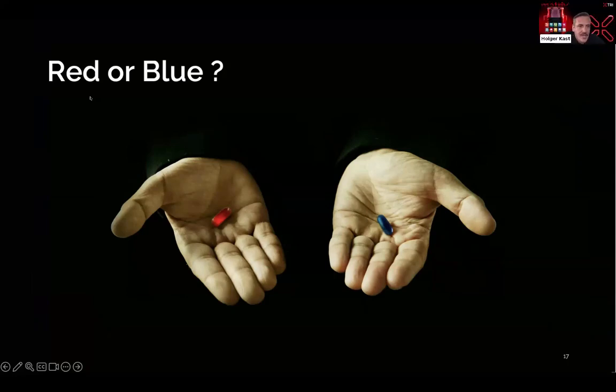Then, because we are running out of time, there was another question. How do you think final restorations will be possible? Maybe some comments about printed final restorations. I think for definitive restorations right now, milled ceramics are still king. You're still going to be milling your definitive restorations in ceramic. That being said, the beautiful thing is that if you design your provisional, which is 3D printed or milled, you can use the same design or something based off that design for your definitive restoration.